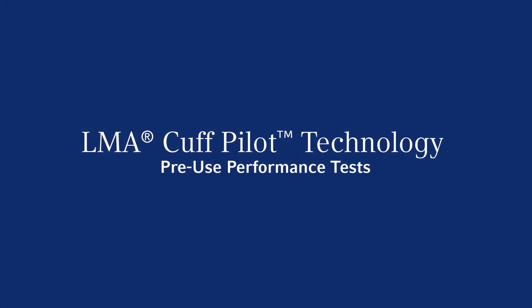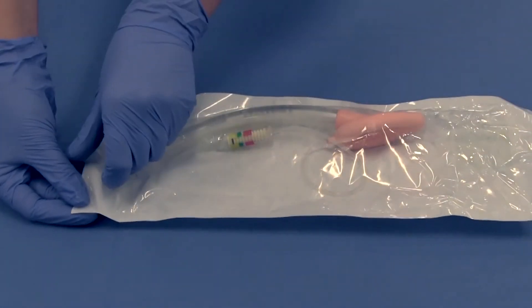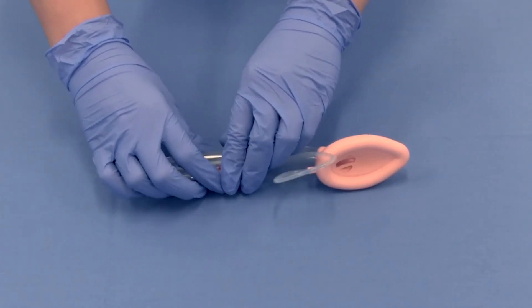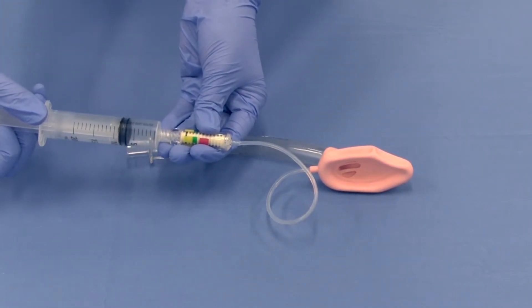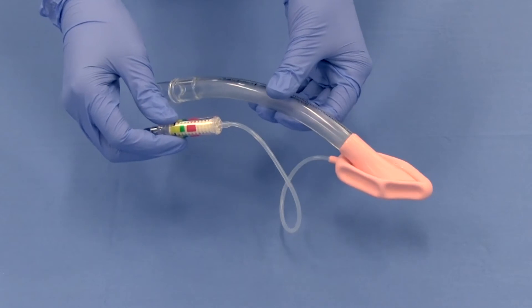Please refer to the product instructions for use for the specific LMA airway you are using to see a full list of inspections and tests which must be conducted before the device is used. The performance tests should be conducted in an area and in a manner consistent with accepted medical practice that will minimize contamination of the device before insertion. For LMA airways with Cuff Pilot Technology, deflate the cuff fully and ensure that the cuff walls are tightly flattened against each other. Discard if the cuff re-inflates immediately or spontaneously, even if only slightly, as this indicates possible damage to the device or valve.